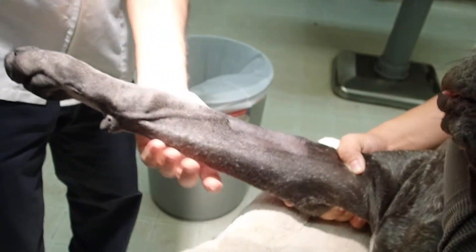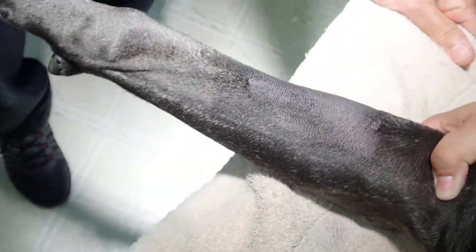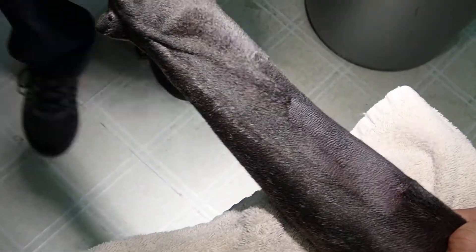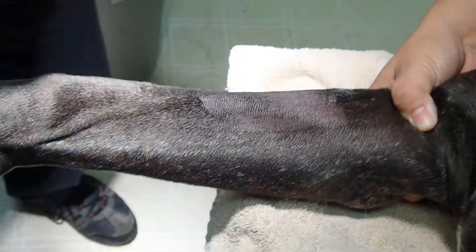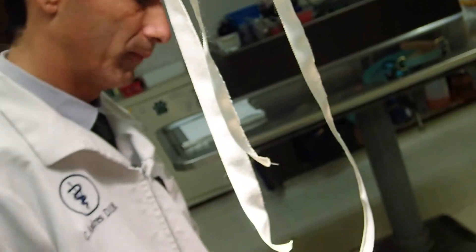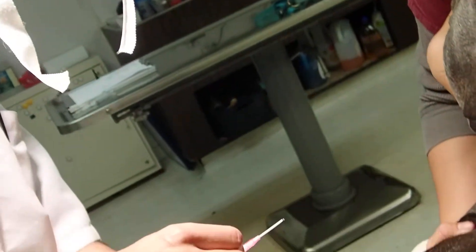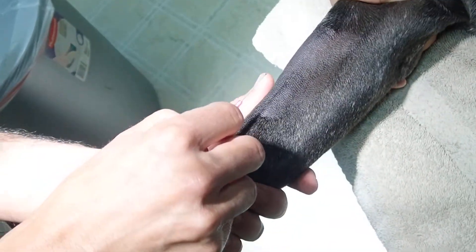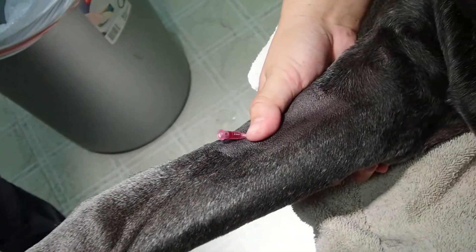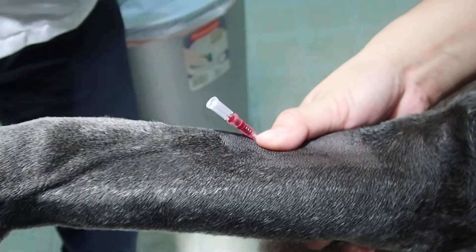In her case she has pigmented skin, but I can kind of see where the cephalic vein is — it's right about there, so that's where I'm going to try to insert the catheter. You always want to go bevel up. What I do is I try to envision giving an intravenous injection with a needle — that's about how deep you want to go with your stylet when you insert it. You don't just insert it superficially or all the way to the hub; you insert it as deep as you think you would for an intravenous injection. If you get a flashback in the flashback chamber, then you can feed it in. I'm going to insert the catheter there, and then I'll grab the filter cap that we had initially and place it. Madison's going to continue holding onto that.